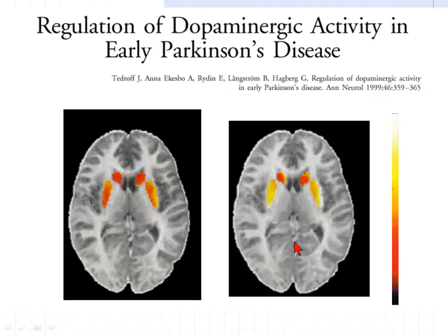Contrast this, though, with early, mild Parkinson disease. You can see that there's relative preservation of the fluorodopa signal, so now this putamen becomes relatively yellowish compared to the DAT. And this indicates to us that there's counter-regulatory change in the expression or activity of the DAT protein versus the AADC. And it's for this reason that our laboratory went forward to look for an additional marker or markers of these nerve terminals that might not show this compensatory regulatory effect.